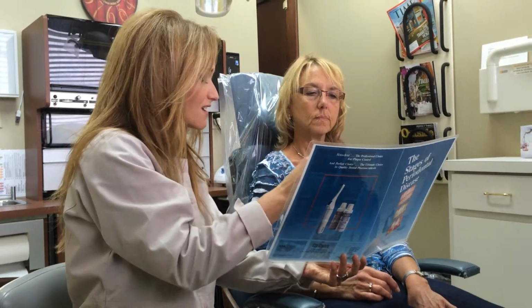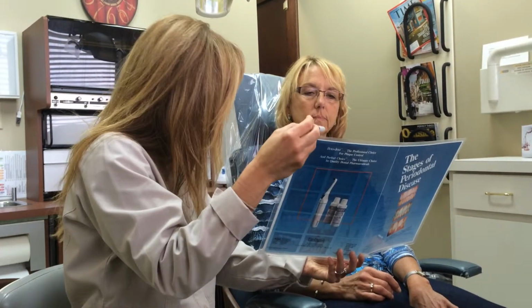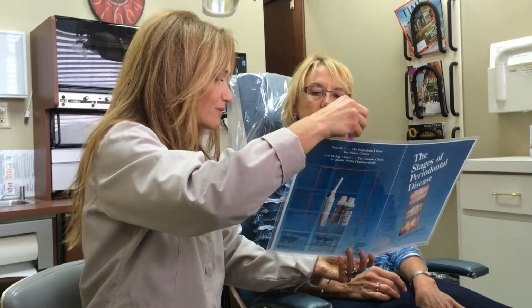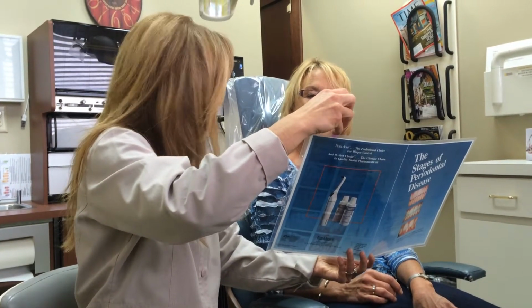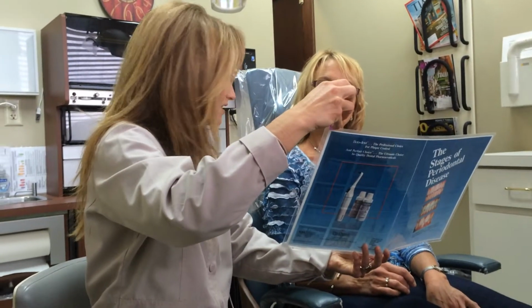Great. The first sign of an infection is bleeding gums. We call that gingivitis, and it's a bacterial infection. When we take our ruler, we'll drop in here. We still get numbers typically from 1 to 3, but when we touch this tissue, there's going to be a lot of infection, a lot of bleeding. The good news is that the bone is not really disrupted at this point. It's not infected, so it's still going straight across here.